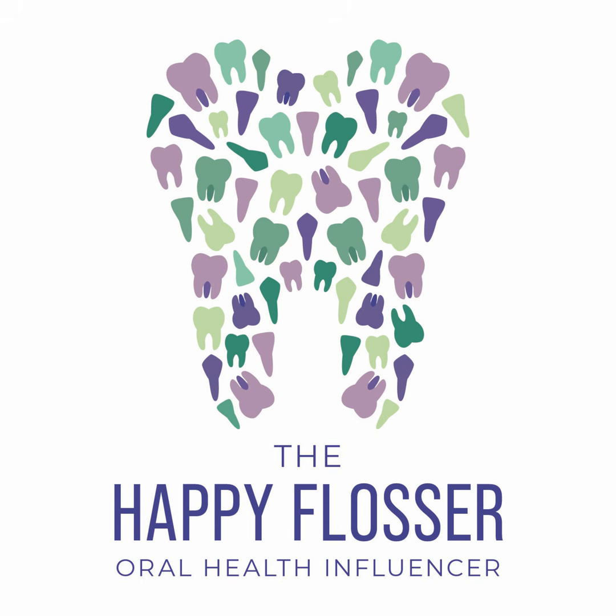For example, someone who recently had ortho or who is in ortho treatment may have had a recent Panorex and they've come to you with discomfort about their wisdom tooth. So if they've had a recent panoramic x-ray, you wouldn't take a new panoramic x-ray. You would obtain that Panorex from the other office, or maybe take a periapical film of that particular area, just as an example.